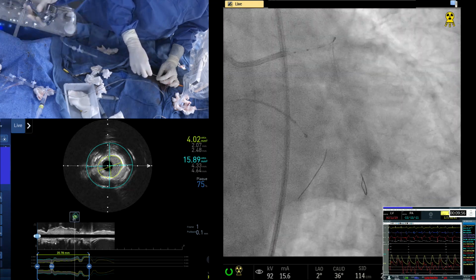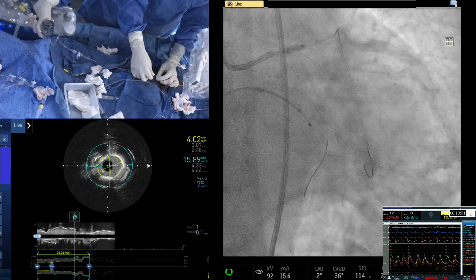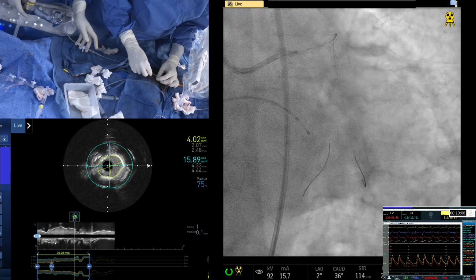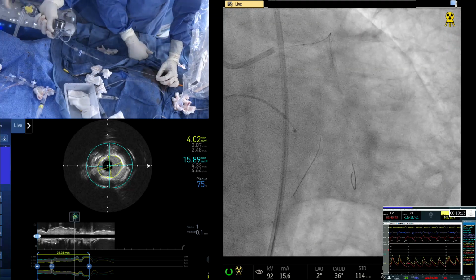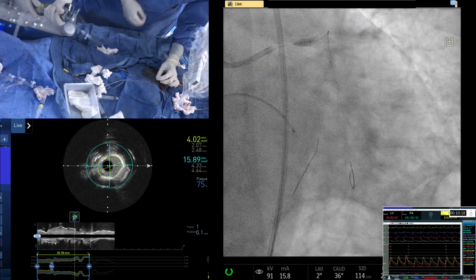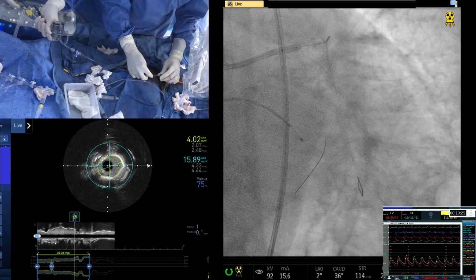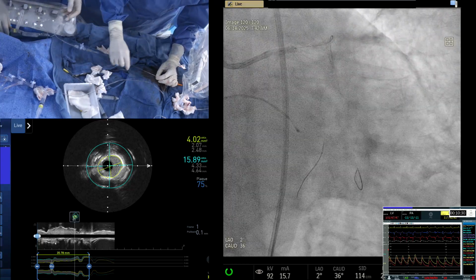Good. Okay, going up. Looks small. Okay, down. And we'll pull back and go back again. No, listen, you have to go inside here also, because you have to decide the length. Yeah, okay, good. Okay, down. Just proximal to the septal, probably there is the lesion, in the cranial projection. Go up here. Okay. Get the IVUS.